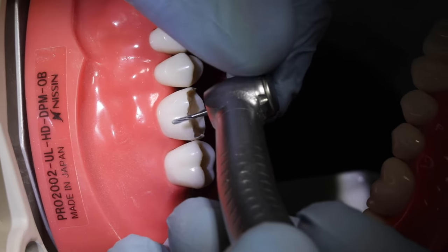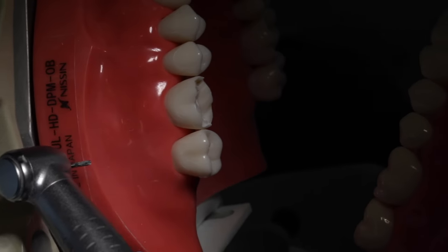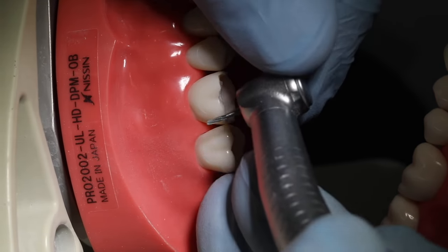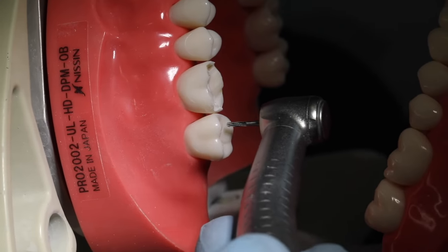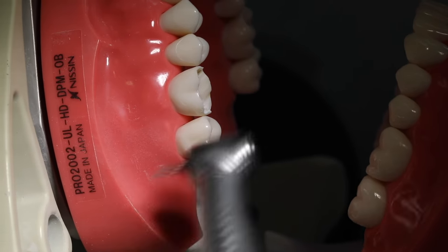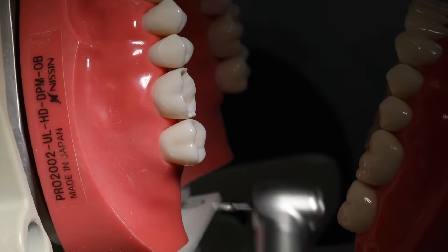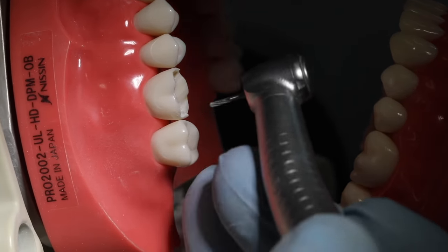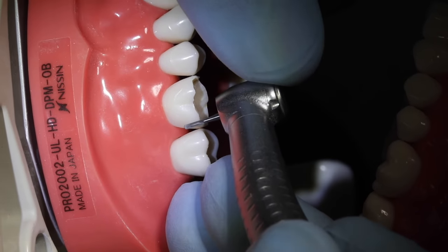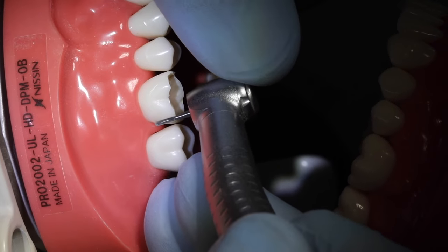The burr needs to be angled toward the gingival embrasure, toward this spot right down in here, so you don't create a big ledge on the back side of the tooth. So the angulation of this cut is really dictated a lot by the shape of the proximal tooth surface and the shape of the embrasure, what kind of an embrasure space we have down there. So let's go ahead and make our distal cut. And again, it's just kind of a brushing motion.